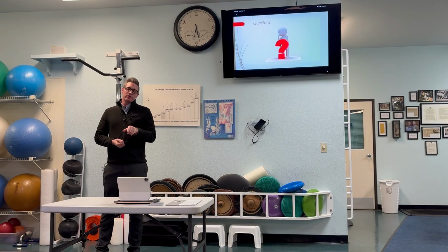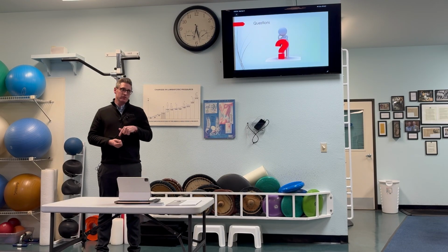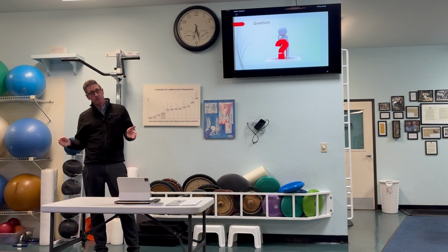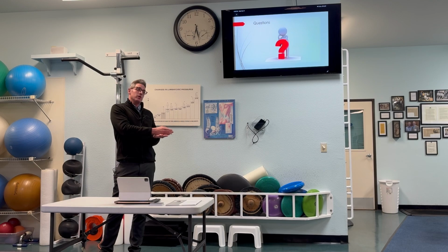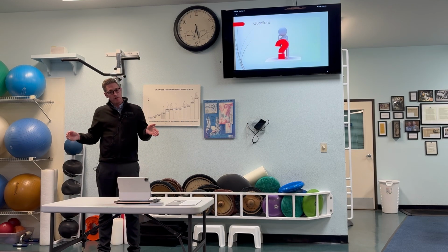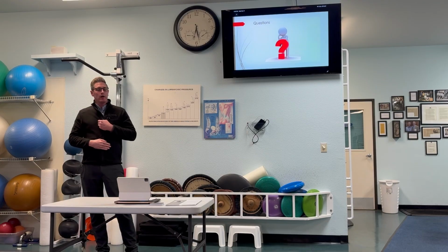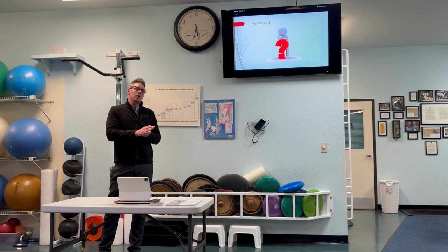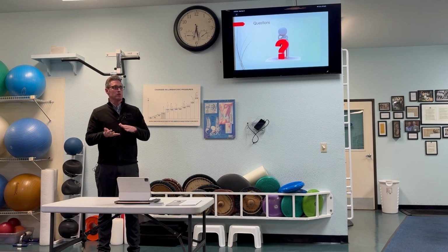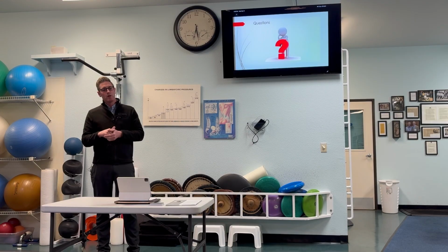So the first ProDisc L was implanted in the United States in 2006. So it's really only been on the US market for like 20 years. The first ProDisc L, I believe, ever implanted was in Europe in 2000. So 26 years of in vivo data. So that particular question I don't think has been answered yet, but just to extrapolate from what we know now, the likelihood of being a candidate at 70 years old for disc arthroplasty is pretty unlikely, just because you've likely developed arthritic change with facet disease and probably a pain generator.